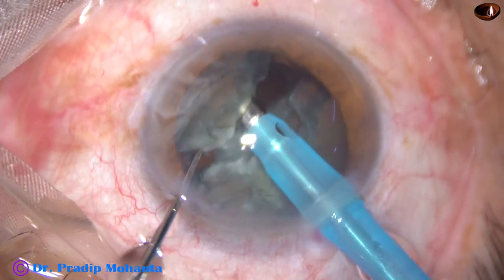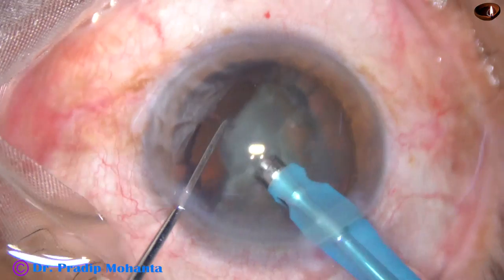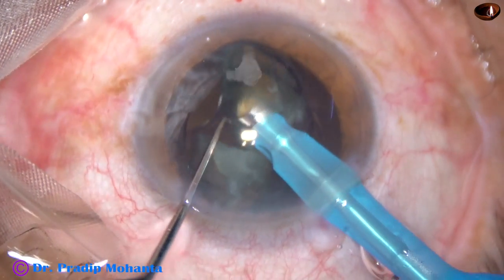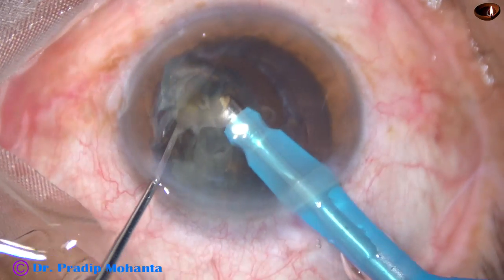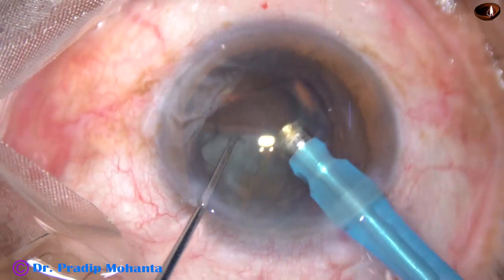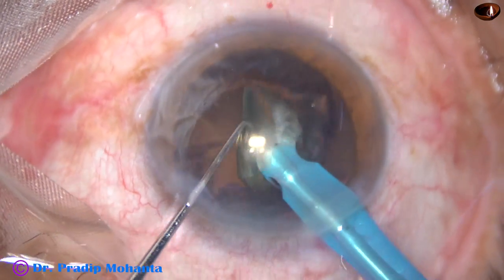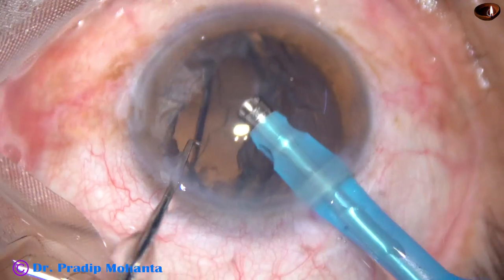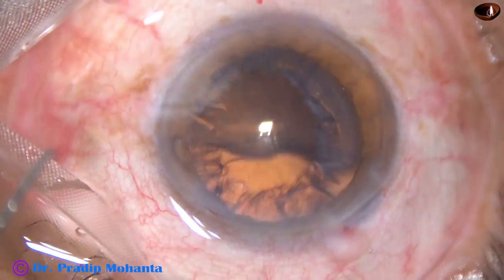Each free nuclear fragment is emulsified. If necessary, it is subdivided into 2 smaller pieces. This is the third nuclear fragment — it is emulsified. Ultrasonic energy used in this case is 50%, flow rate is 45 ml per minute, vacuum is 450 mmHg. This is the Oatley Catarix III.